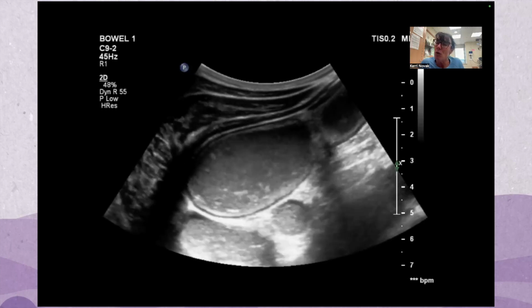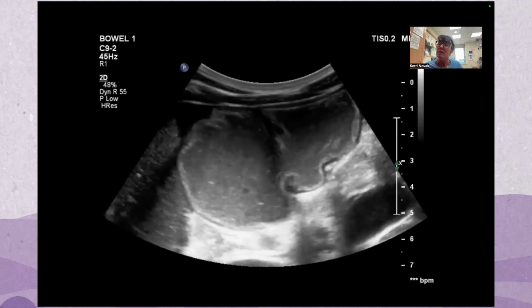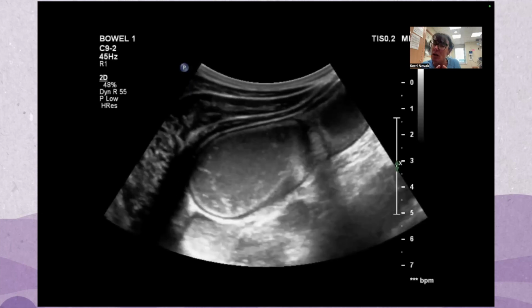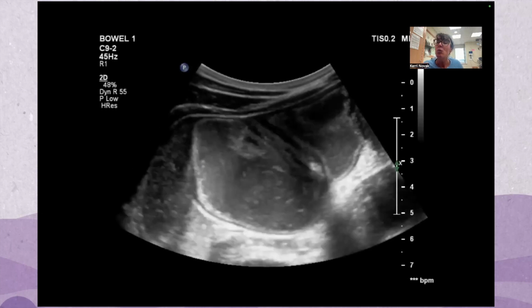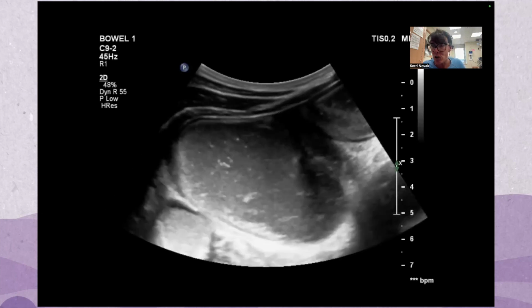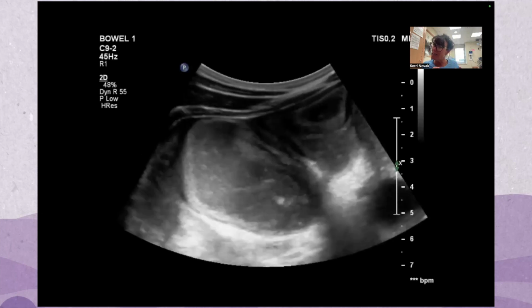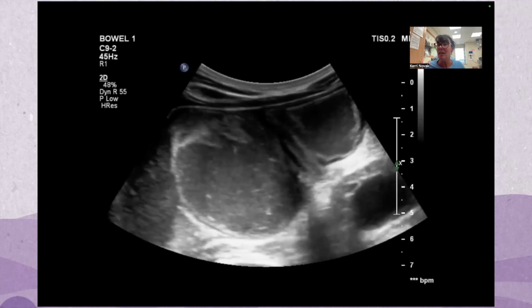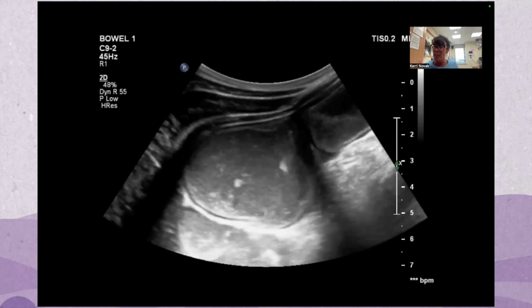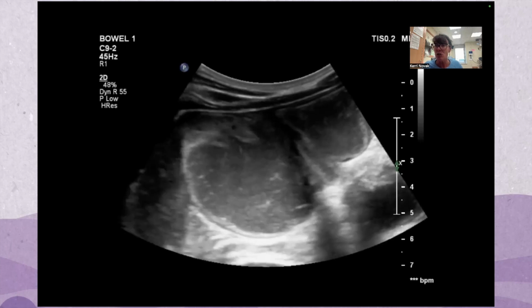When people feel bloated or have pain, and we can do an intestinal ultrasound and it's normal, this is altogether reassuring. We can see the bowel in cross-section, and we can see that the function is actually normal. We need other probable measures, maybe even artificial intelligence, to help us understand when the bowel function is only slightly abnormal. And this is another way in which intestinal ultrasound might add value, because it's one of the only tests that we can look at motility in real time while you're watching the screen with us.